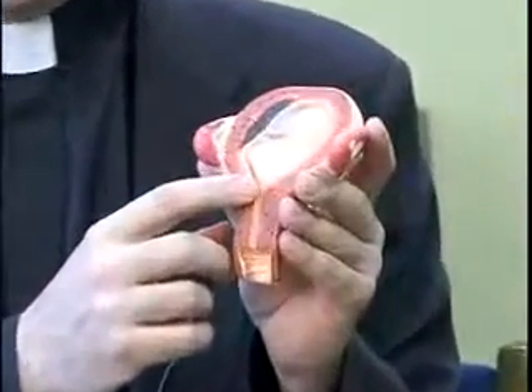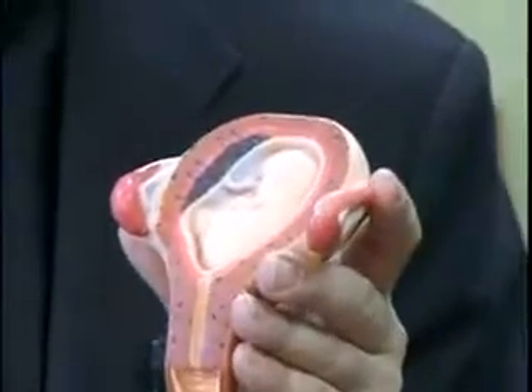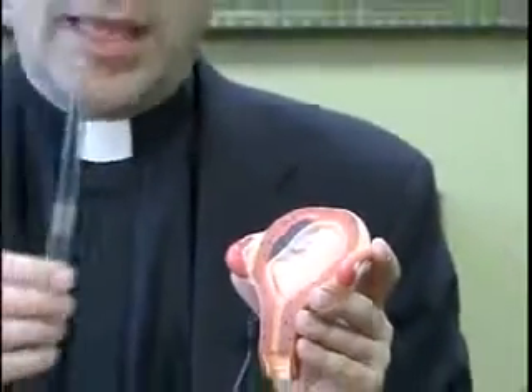This is the same size of the baby as those little feet represent that pro-life people often wear. And I have here in my hand a hollow plastic tube called a cannula. This instrument I have in my hands was actually used to kill babies in the way that I'm about to describe.